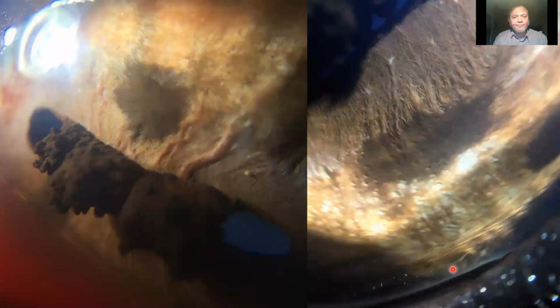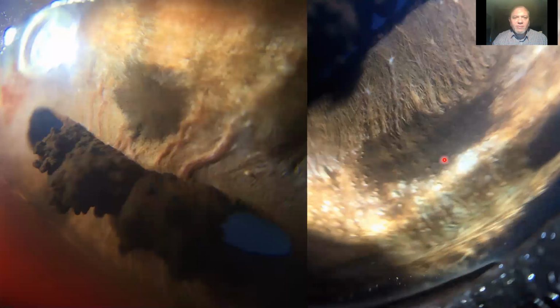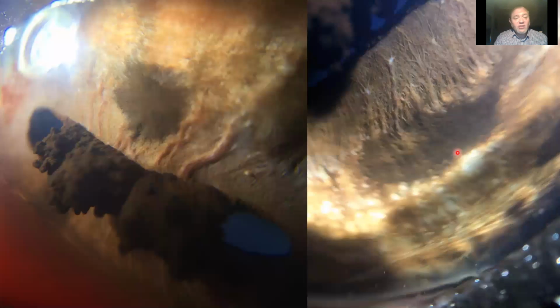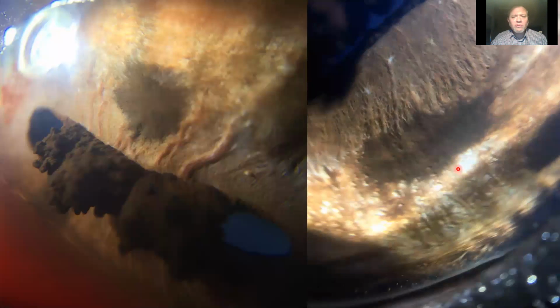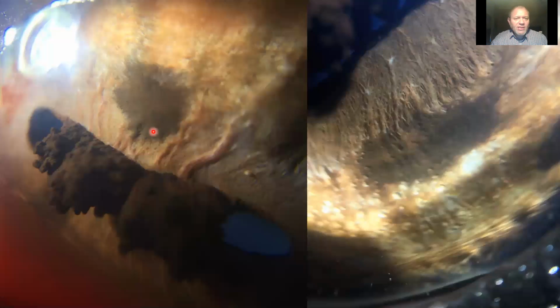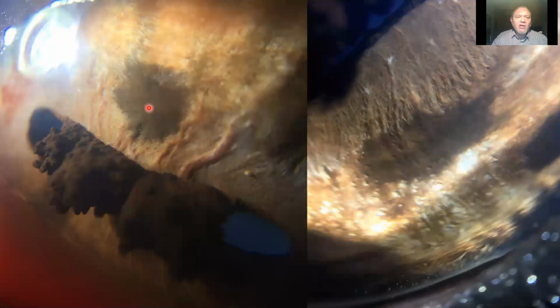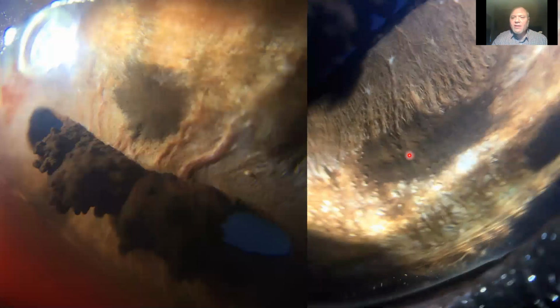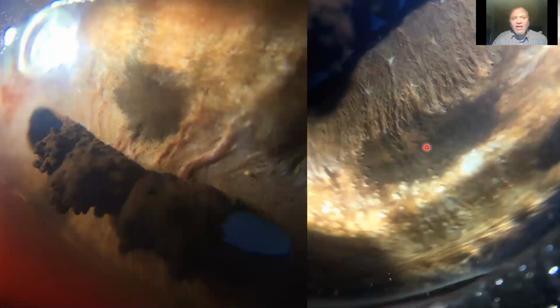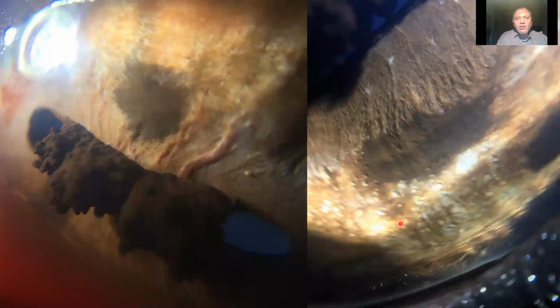So again, we've met this beautiful picture of this iris melanoma before, and this is very useful for being able to monitor these lesions. It's often difficult to differentiate them from iris nevi or freckles. One on the left, I'm very happy the centre of the lesion is starting to become mounded and obscure the iris architecture. Here we can still see iris architecture through all of that lesion, but I'm very suspicious this right hand lesion is on its way to becoming an iris melanoma too.